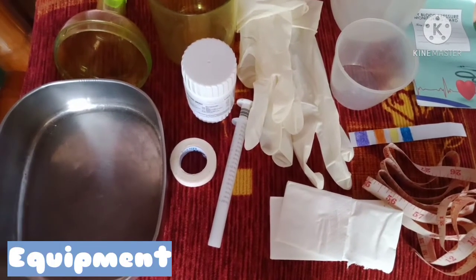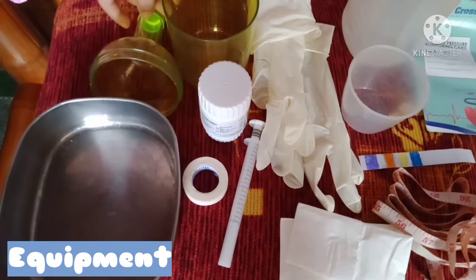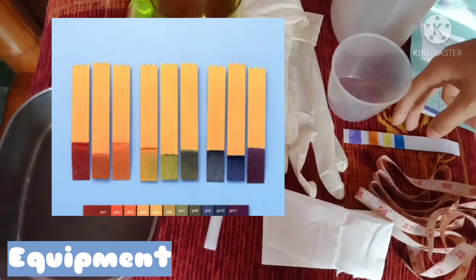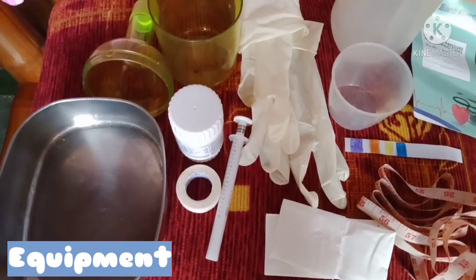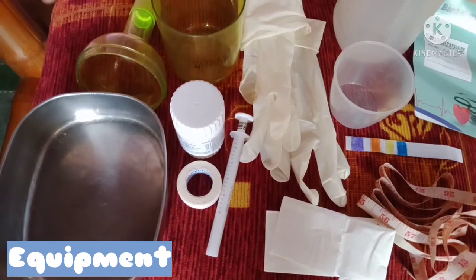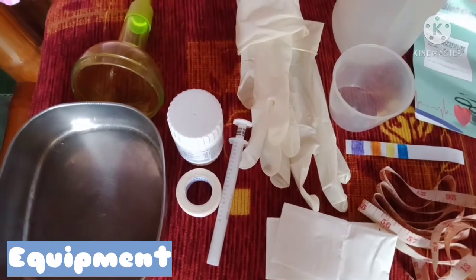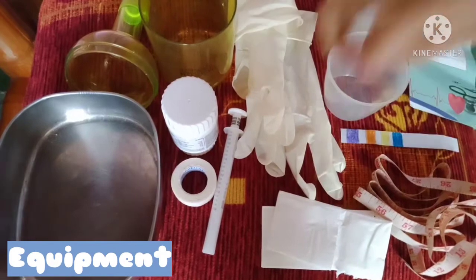For the equipment, we need a disposable feeding bag or tubing or ready-to-hang system, two 50 ml syringes, a stethoscope, a pH indicator strip, the prescribed enteral feeding formula, gloves, equipment to obtain glucose by finger stick, a kidney basin, water to follow feeding in a measuring or calibrated glass, and also a measuring container from which to pour the feeding if the syringe method is used. And lastly, tissue.